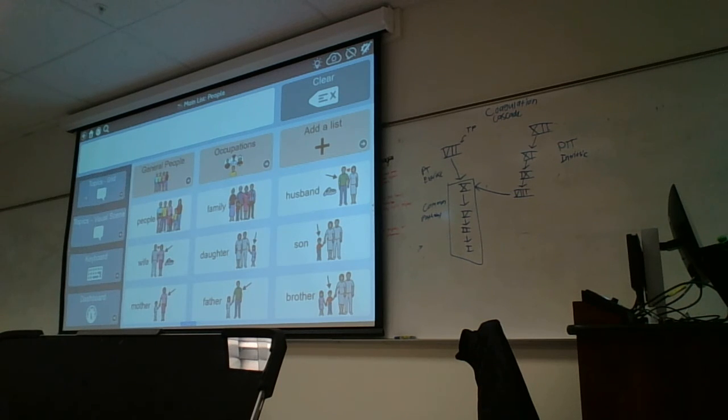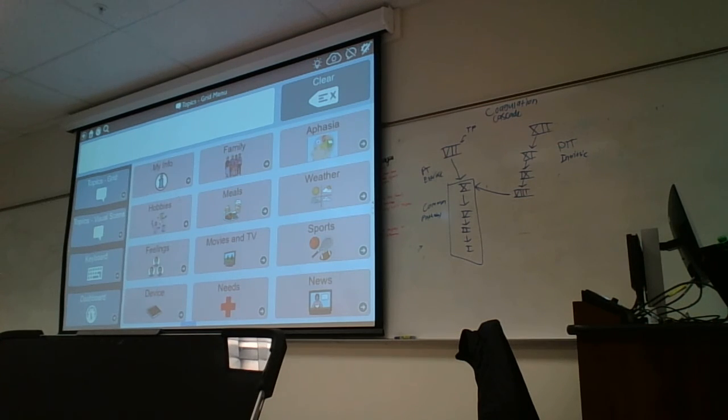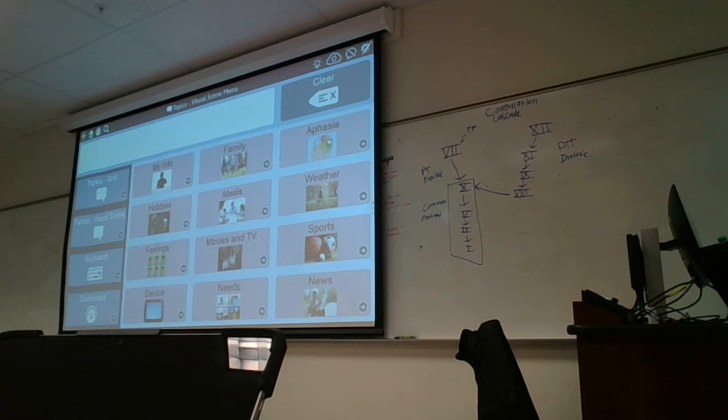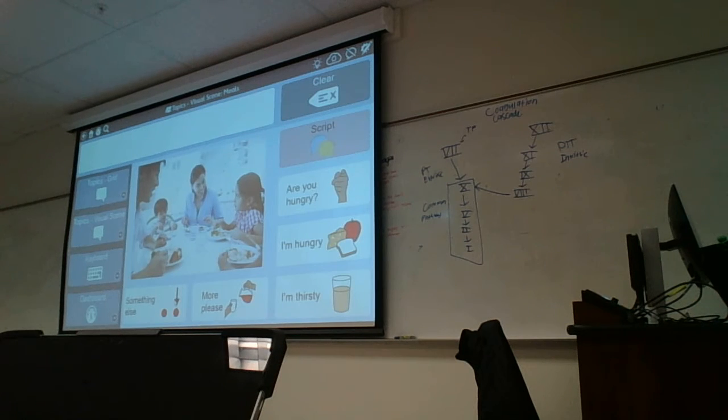Within here, there's also topic grids. So these are, again, topic-specific areas that could be personalized and programmed so that those messages are on there for their caregivers. The visual scene is a nice area. This is, again, when you're working in speech therapy sessions, you can bring some of these topics up to be able to discuss and make some comments about topic-specific areas or ideas, right?